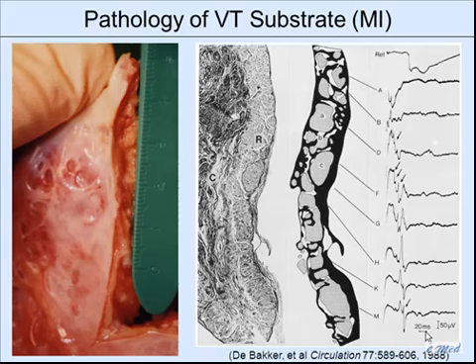About 20 years ago now, a little longer than that, Jacques de Bakker in Holland had some very innovative work on the pathology of these patients. And this is a specimen that we had from the operating room. Actually, this is a pre-transplant patient. This is his old heart.